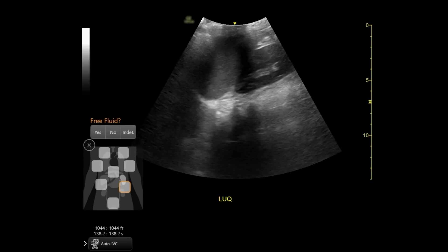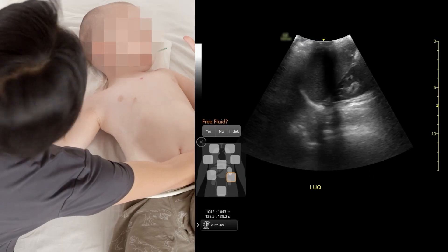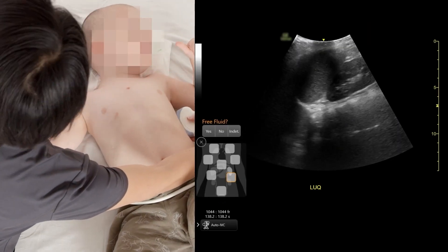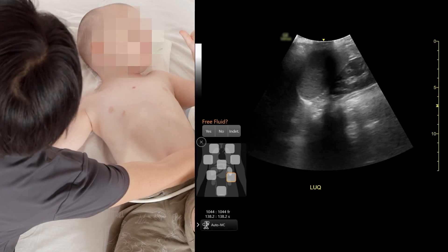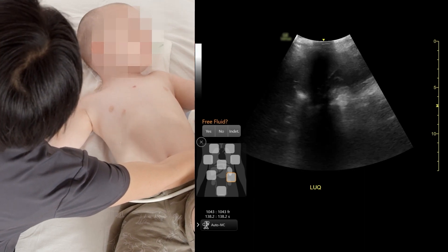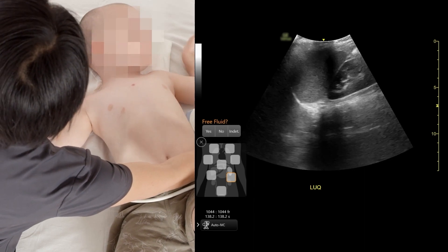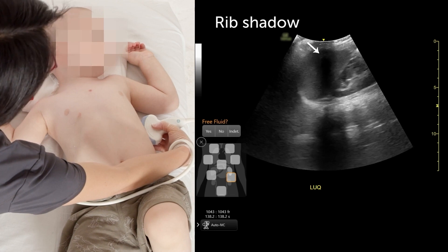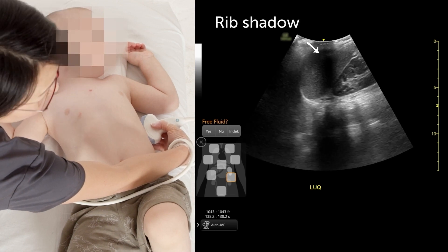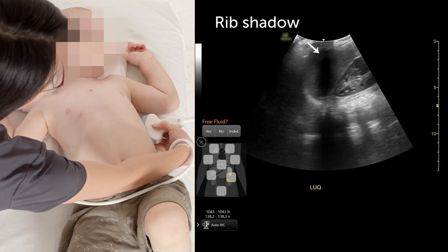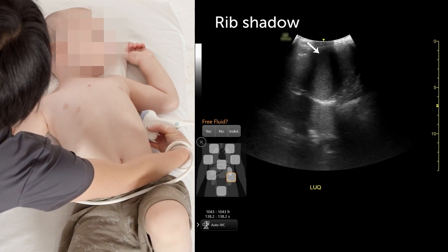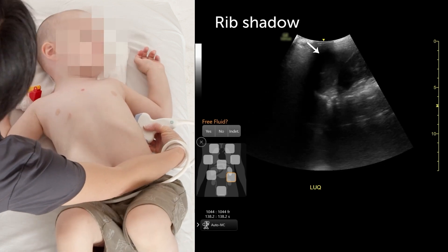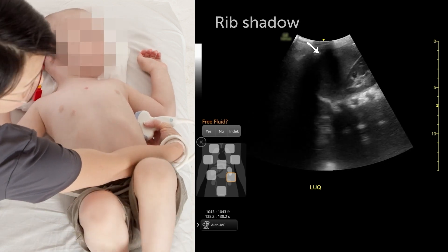A lot of times the spleen likes to hide high up in the rib cage where the rib shadow can be in the way. You may have to put the probe higher up, and sometimes you have to rotate to get away from the rib shadow.